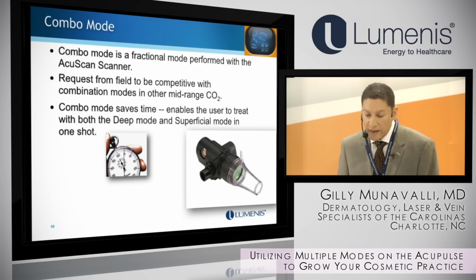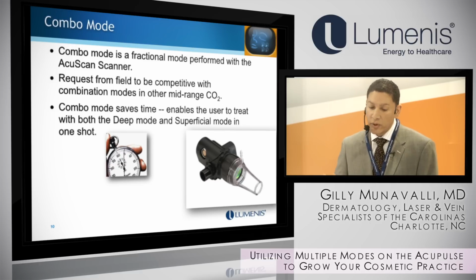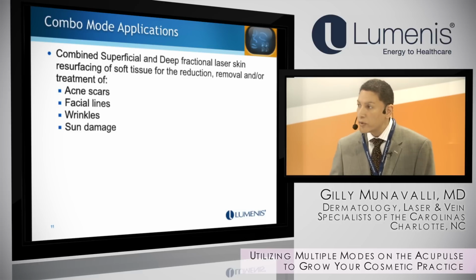As far as the combo mode goes, this is a lot of background information that you already know. I like the fact that they can happen simultaneously, but you can also do either one individually, however you want. Our indications in our office are typically fine lines, wrinkles, periorbital wrinkles, perioral wrinkles, acne scarring, and some photoaging, which I typically change for the M22, depending.